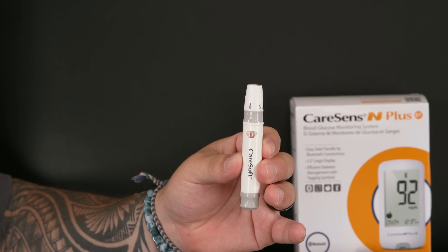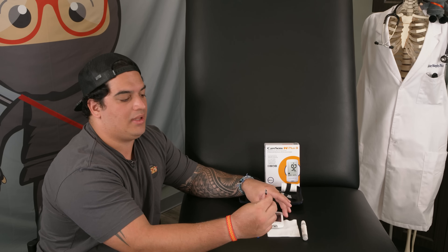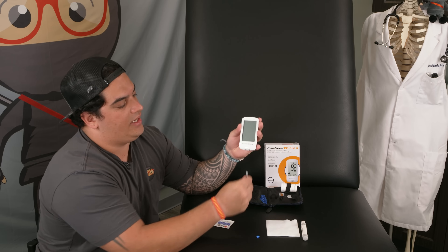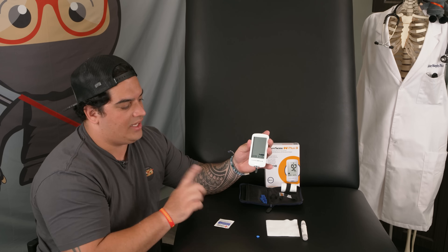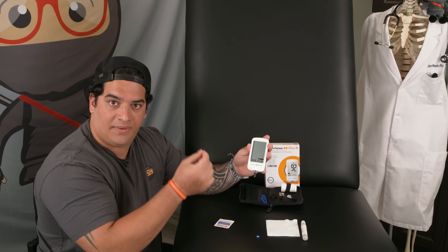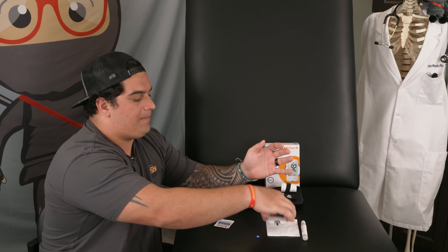Now let's get the glucometer monitor ready. I'm going to take one of the test strips and insert it into the monitor. The nice thing about this is that inserting the strip actually turns the glucometer on for you. Now I have the device ready to go — next I'll prep my finger, deliver the skin prick, and collect some blood to get a reading.